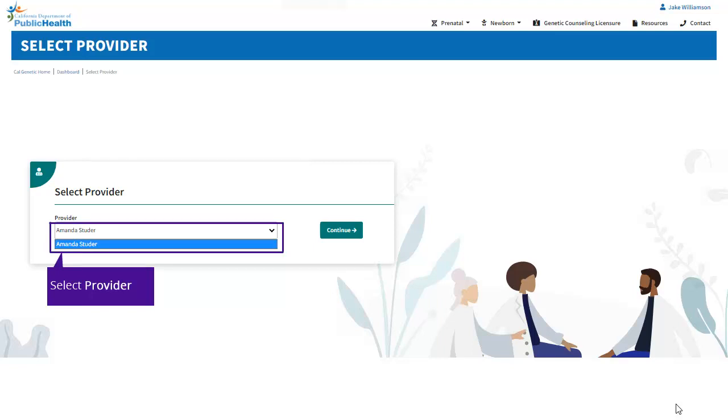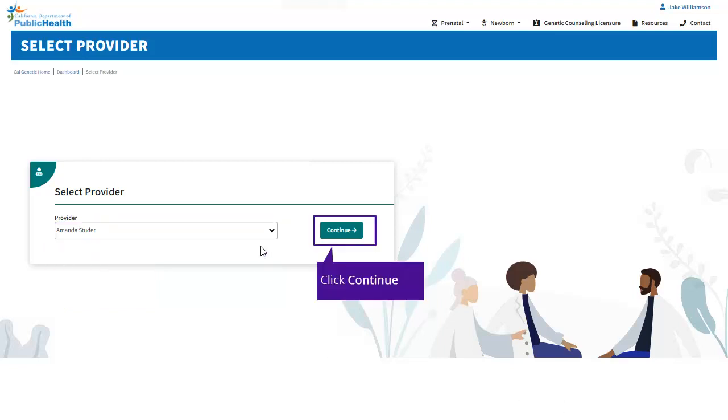Select the Applicable Provider from the Provider drop-down. Click Continue to navigate to the PNS Search Results screen.